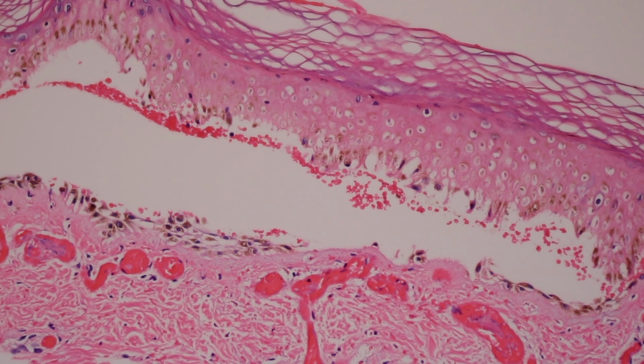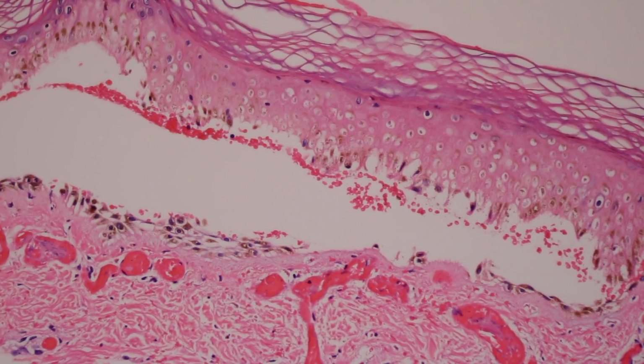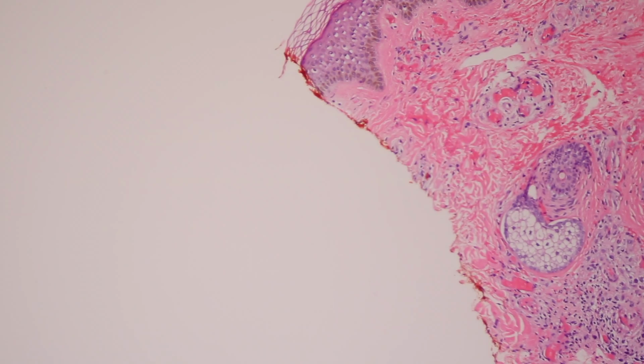And again, look, there's nice orthokeratosis up top, almost no parakeratosis or anything chronic here. This happened really suddenly, and so that's, again, the sign of ischemia, and you don't have to look far in this biopsy to see where the ischemia is coming from.